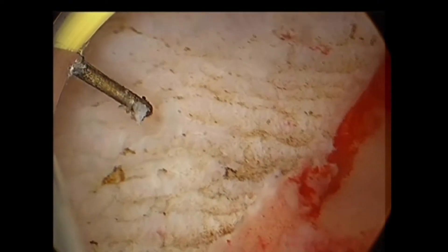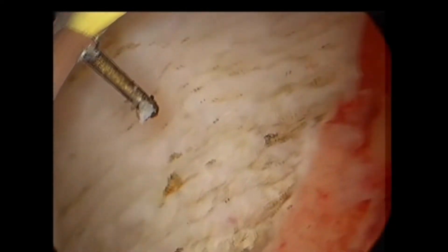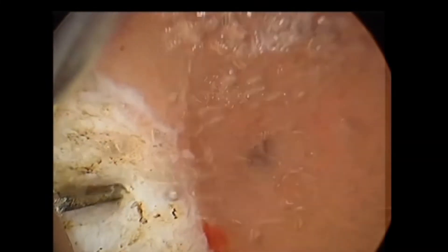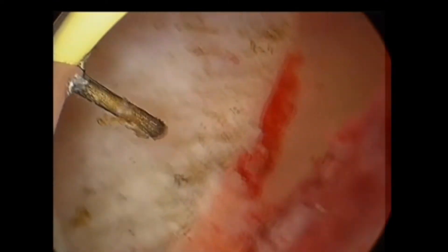This brings us to the controversial debate: should we excise and remove the septum? I believe there is no need to do that. Looking at this part of the video, you can see the septum scar is at the same level as the rest of the endometrium. The septum tissues that you cut have retracted — snapped out like elastic fibers — and jumped back to where they belong, into the anterior and posterior wall of the uterus. Excision and removal of these fibers actually deprives the uterine wall of a supporting structure.